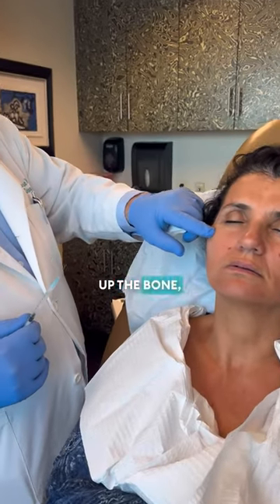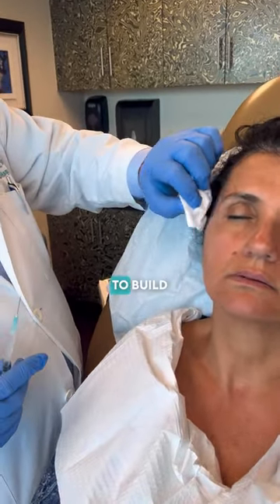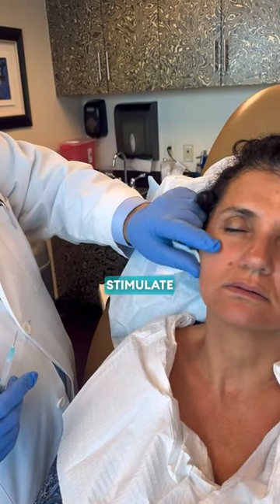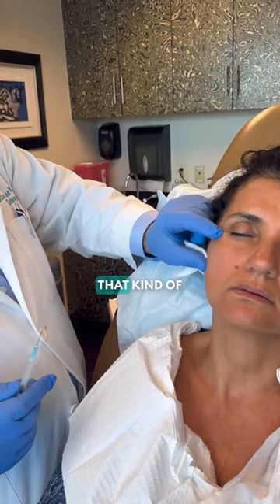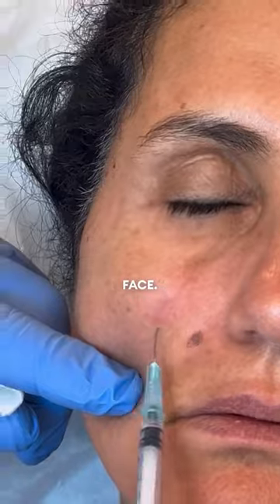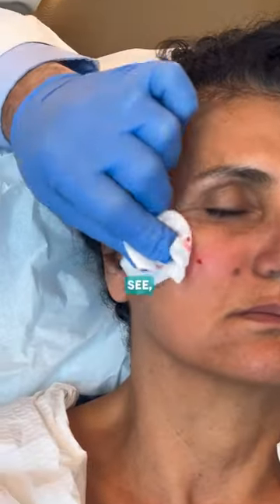We work our way up the bone, the zygomatic bone, to build this lifting arc, and then we go along the jaw — the whole contour little by little, stimulating the skin. It's like a little liquid lift that kind of stimulates everywhere and lifts the whole face. We're building up this cheekbone here to give that nice lift.